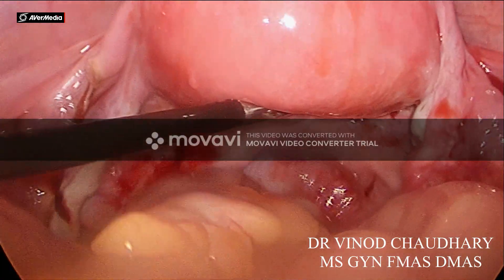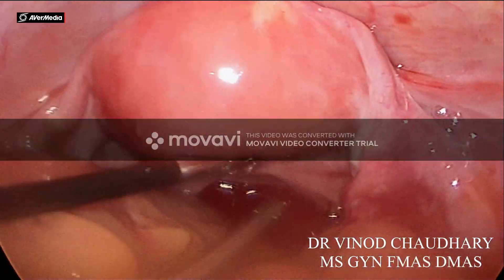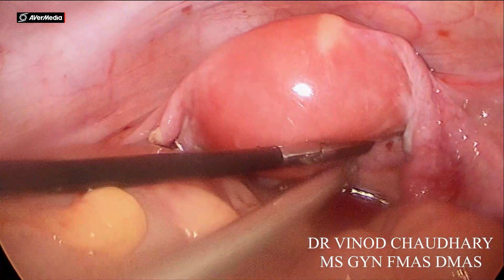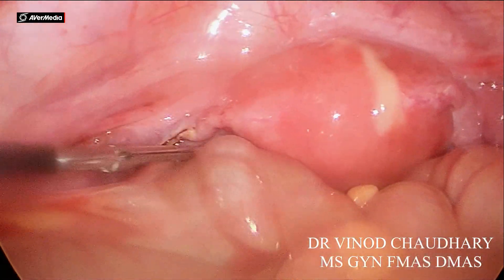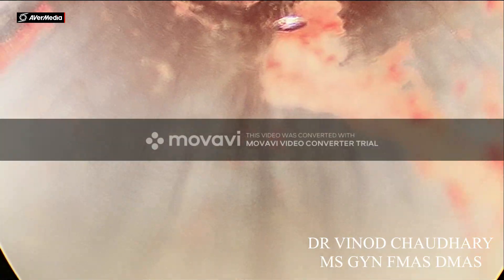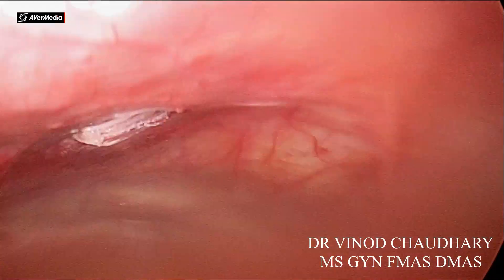We have not used any manipulator in this patient. It is almost clean now. We will remove the trocar. We have only used three trocars — this is the first, this is the second.